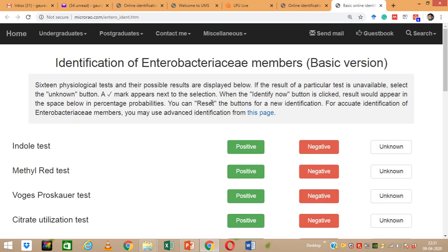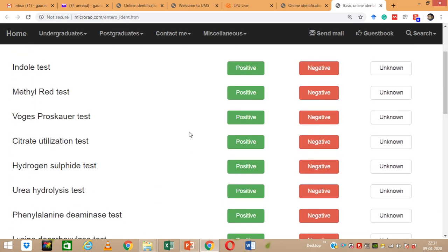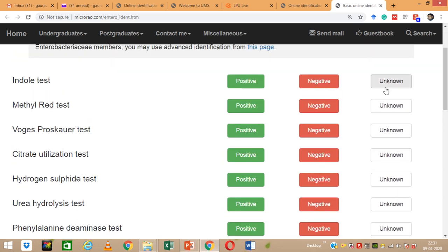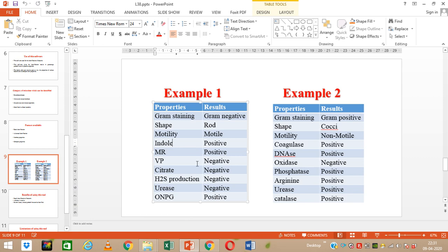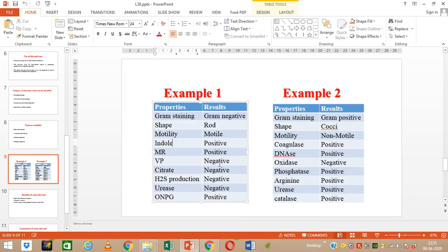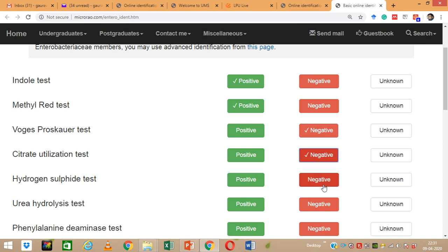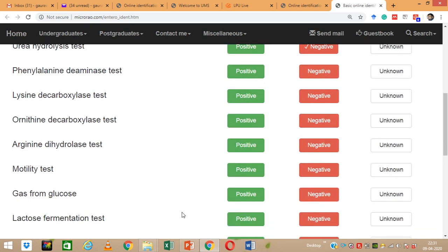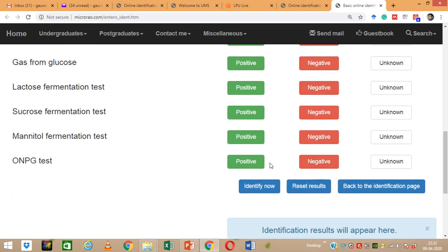The page asks whether each test is positive, negative, or not done. We have results: Indole positive, MR positive, VP negative, Citrate negative, H2S production negative, Urease negative. We also have ONPG which was positive. For other tests which we have not done, we can leave them or select unknown. We are filling in our available results and leaving the rest, then clicking Identify.